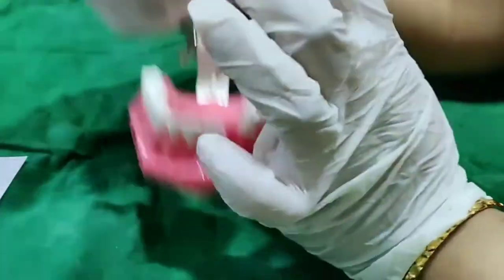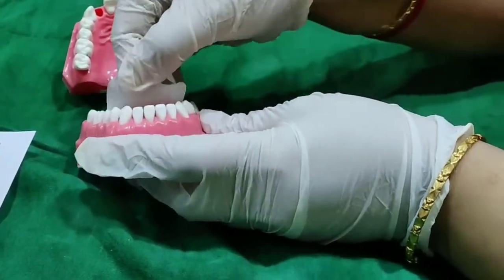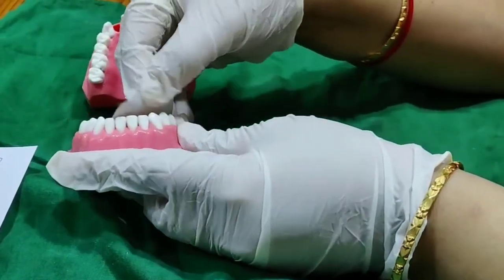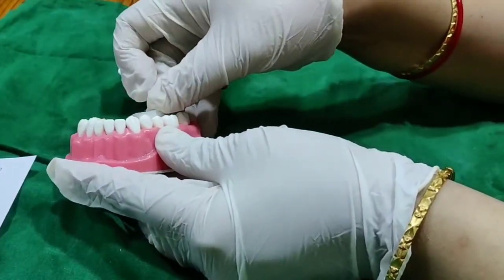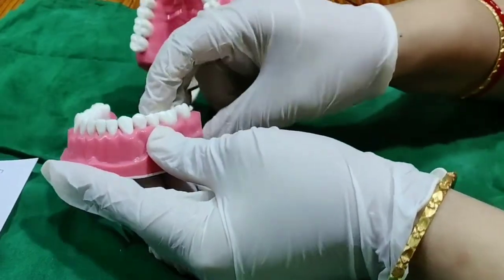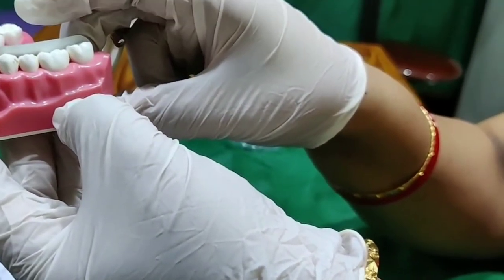For lower anteriors, place the film accordingly. In the patient's mouth, you cannot rotate the film freely. For the lower canine, the canine should be at the center. For lower posteriors, the film border should be 2 mm above the occlusal surface for diagnostic. For endodontic, it should be equal to the occlusal surface, so the apex will come at the center of the film.